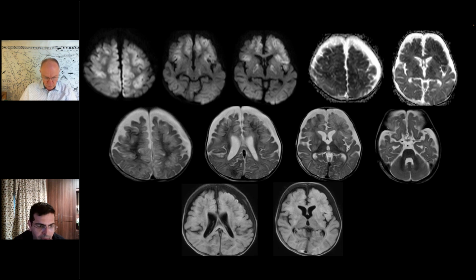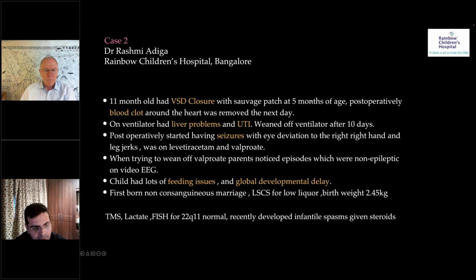So those two remain the big differentials here, isn't it, Nihaal? I don't think we can take it any further at this point. Which one is because of HIE secondary to the surgery, you think? It can be, but you're not giving a history of sudden deterioration after the surgery either, are you? Now, if you go back to the previous slide, we all thought this was done 6 months later, actually.